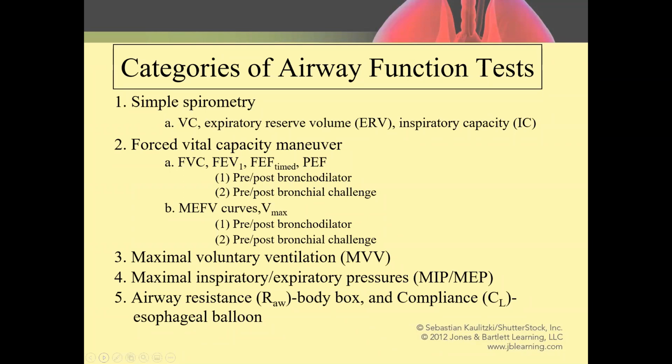Then the forced vital capacity maneuver, which, for a lot of the bedside testing that's not done in a lab, a lot of the figures that are extracted at the bedside are extracted from the forced vital capacity maneuver. Just a quick word: we throw in forced vital capacity, and I did mention Wright's respirometer. A forced vital capacity should not be done on a Wright's respirometer.